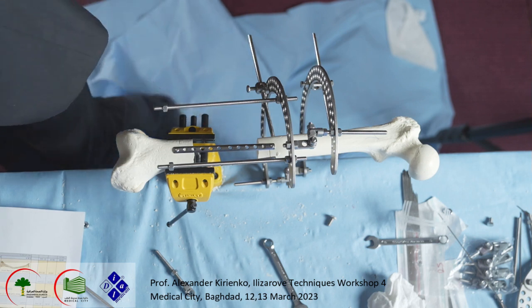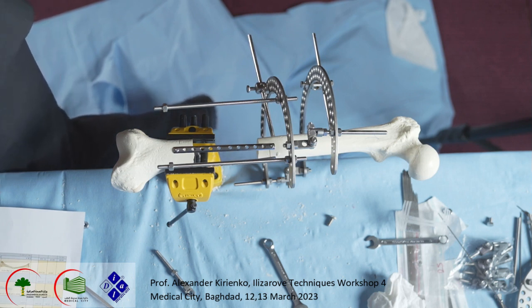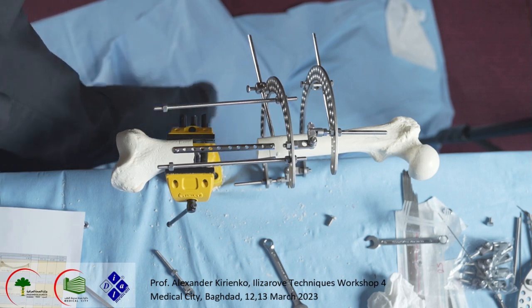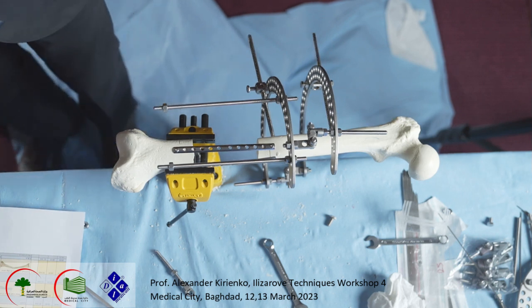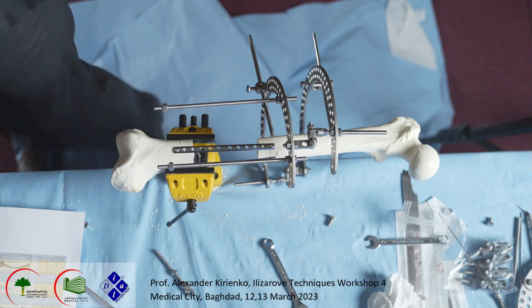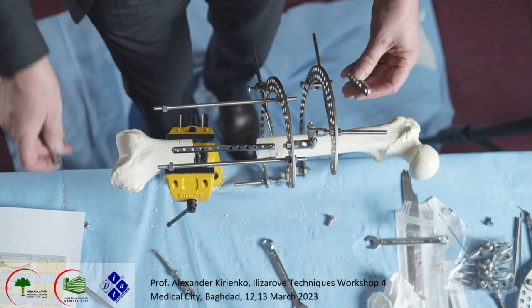Come si chiama? Placca curva. Or in any case, there is a space of your fantasy for connection.